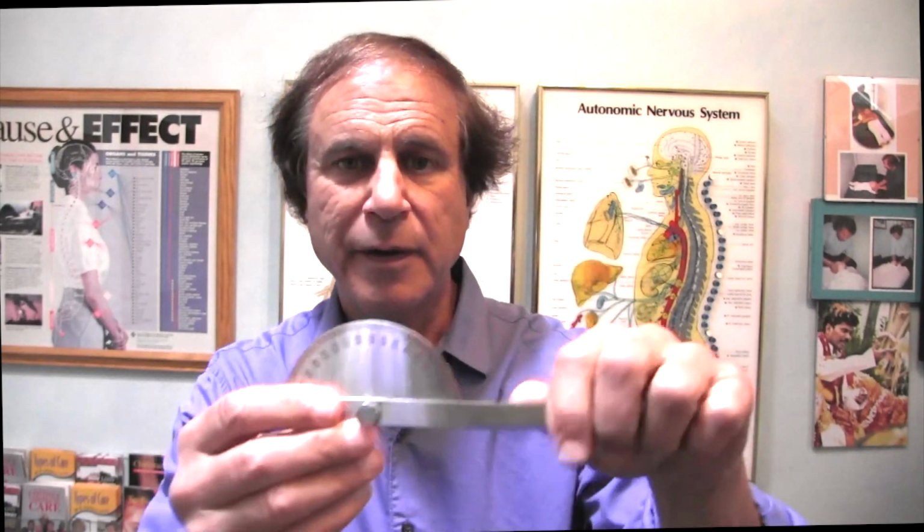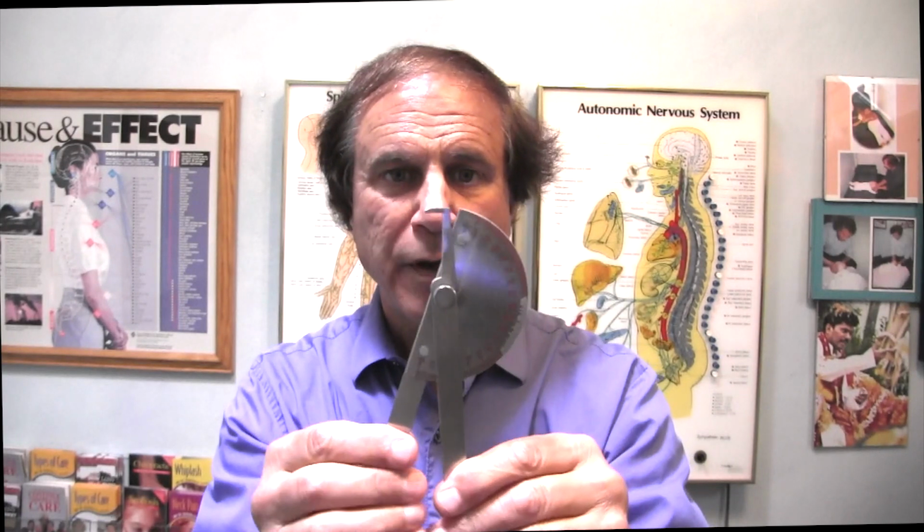When you think about it, they're kind of like the protractors you sometimes use in trigonometry, or even kids use to draw semicircles, and of course you can measure angles with them. That's basically what a goniometer is. Now you might ask, why would you want to use a goniometer? I'm not going to get into a whole spiel about it here. I just want to show you how to use it. But real quickly, a few reasons.